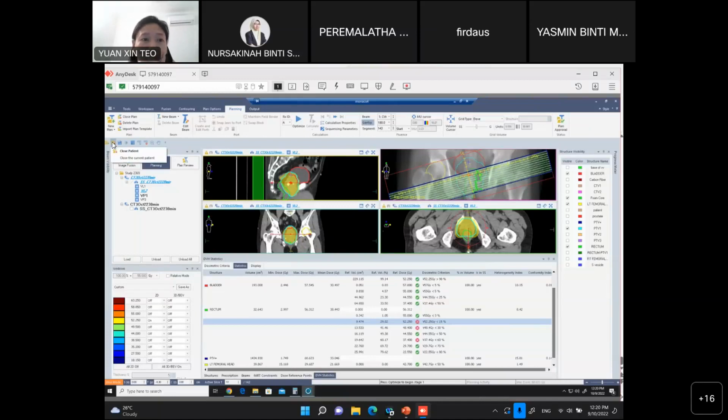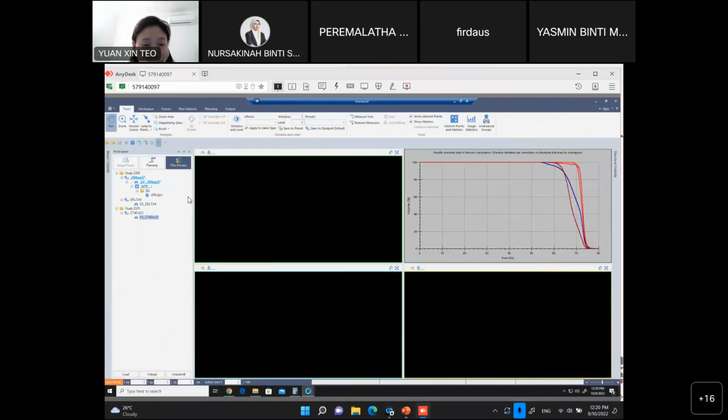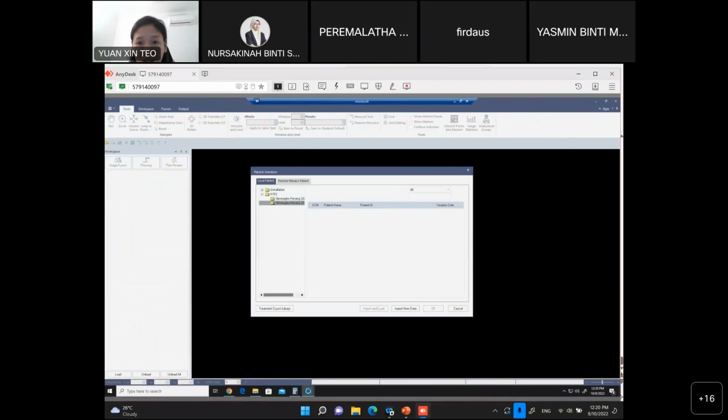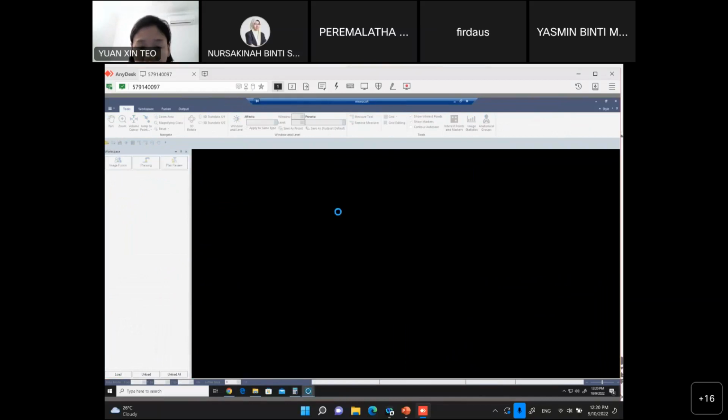Okay, let me open that case for you. So I can tell you here what we can do. You can see we actually scanned at 20 minutes, 40 minutes, and 50 minutes, but still the volume can't be achieved.